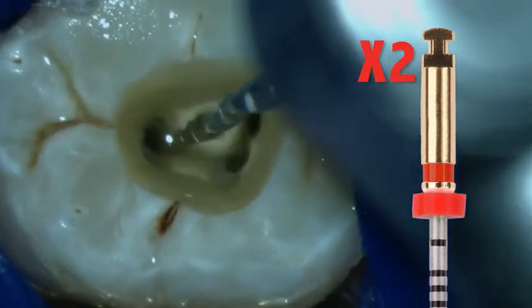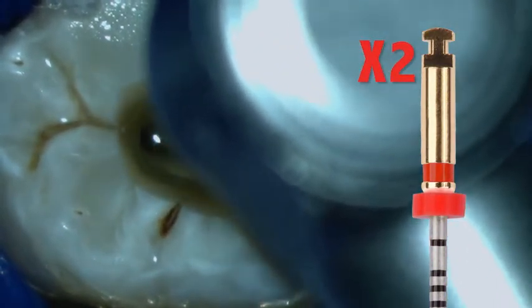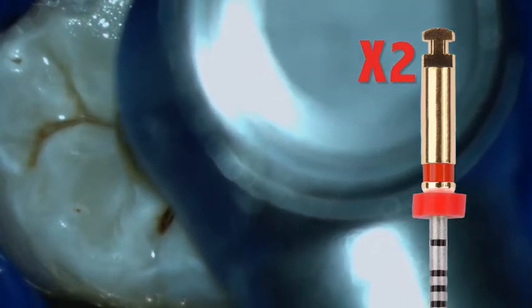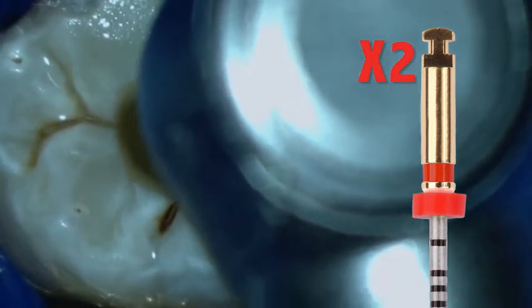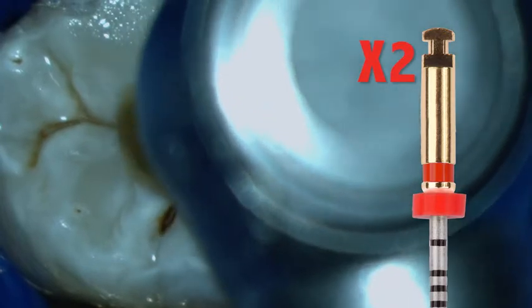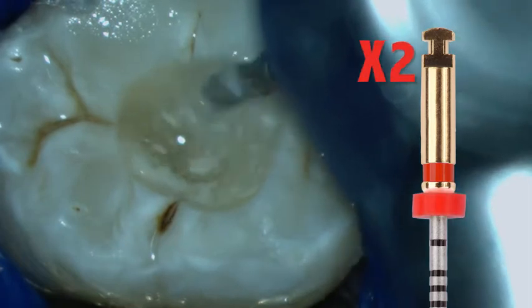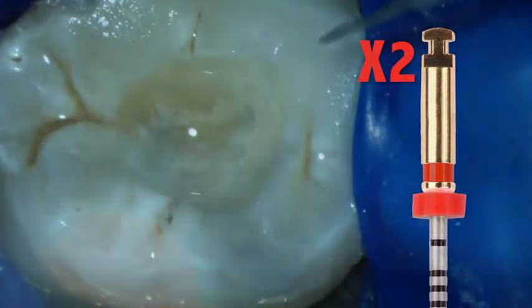The next instrument in the ProTaper Next sequence is the X2. It is also used in a push-pull fashion over short amplitudes of 1 to 2 mm. It may also be noted that the use of these files produces a churning effect or turbulence, which facilitates the removal of dentin debris and the cleaning of the canals.